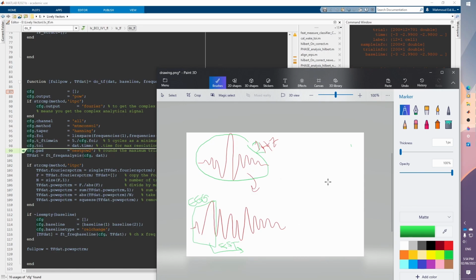So what this means, if we look at the time frequency plot again, but we are applying the short Fourier transform, we have a window, so we have a center time for this window. Right now we are filling this by putting all the frequencies for a specific time. So we look at the center time, we estimate all the frequencies, so 1 Hertz, 2 Hertz, and so on.